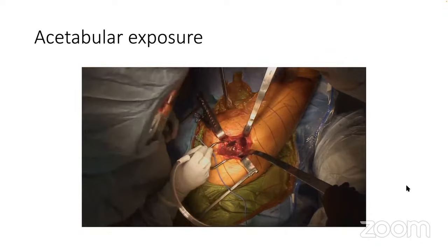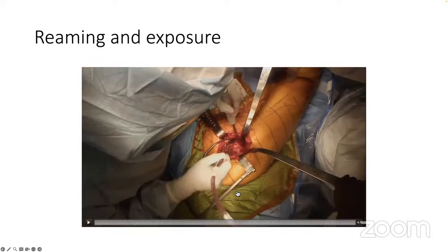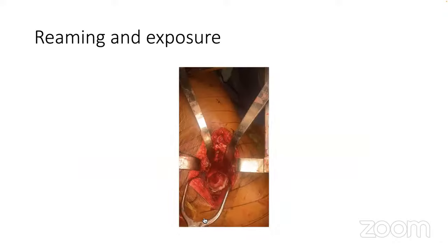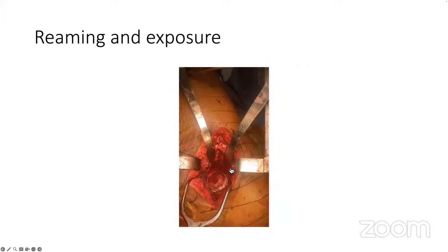I'm taking out the labrum there. You can see now very good exposure to the acetabulum. This is how the exposure should look from the top. I feel this is an important component — the prongs are on the capsule, not on the nerve. The packed suture helps keep it in place. The front prong is on the medius and some of the minimus anteriorly, then the obturator foramen retractor and the anterior retractor give you nice circumferential exposure.